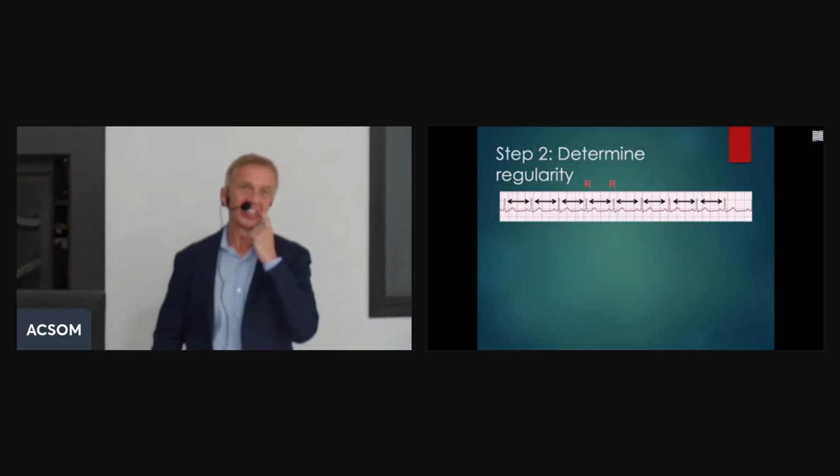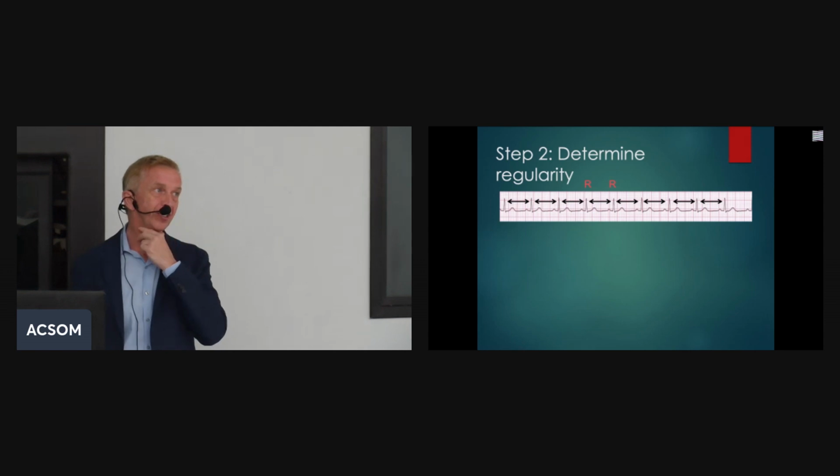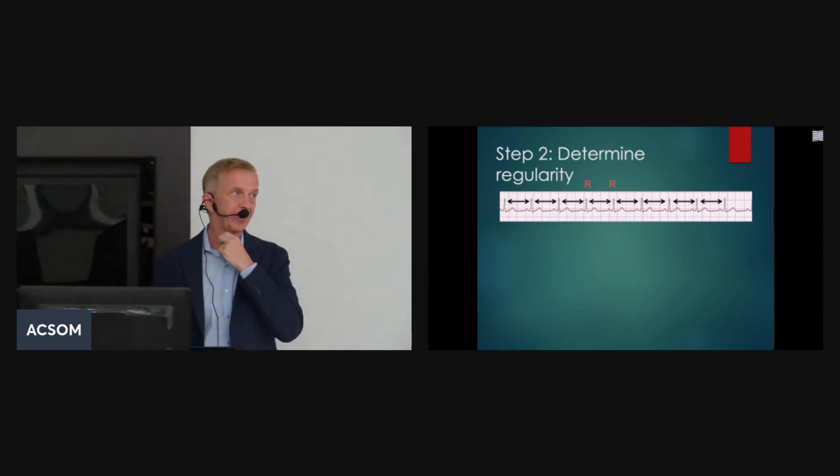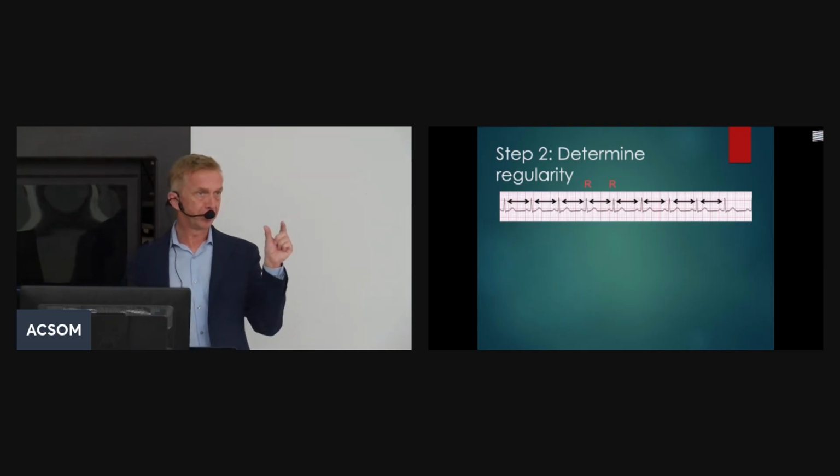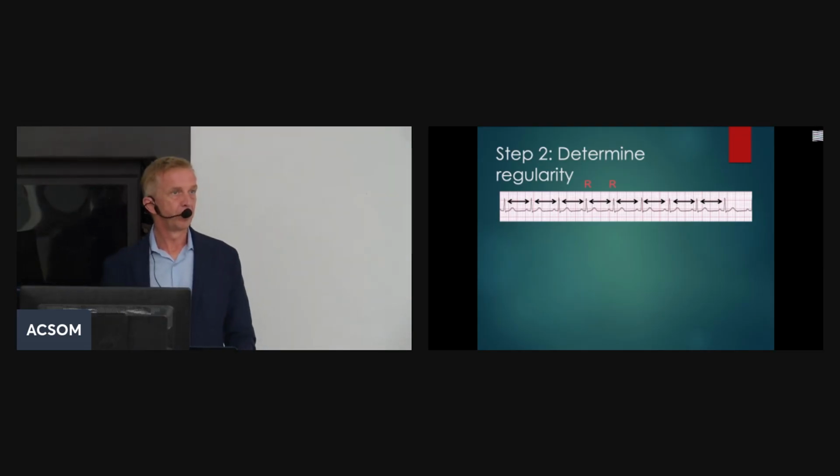It's a type of heart rate variability. Yes, it's called sinus or respiratory arrhythmia. Inspiration and expiration slightly change the heart rate. So there is a little irregularity between the QRS complexes even in patients who have normal rhythm.